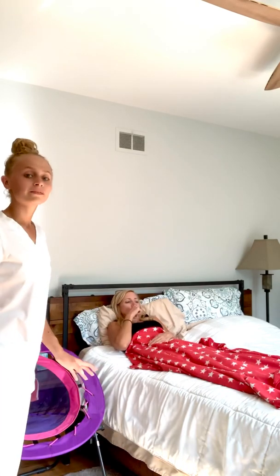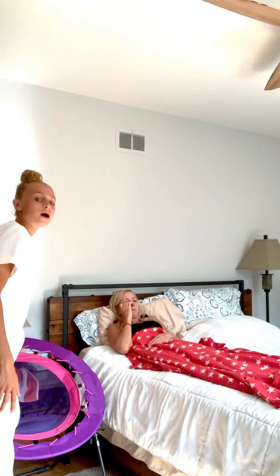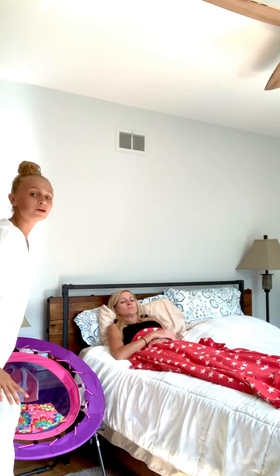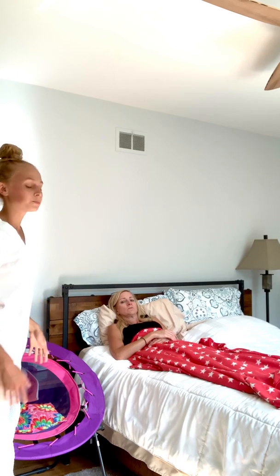So now we have gathered all of our supplies. The supplies that we are going to need today are a cushion that we are going to be placing on the wheelchair, and then a robe, a bath towel, non-skid footwear, a paper, and also a transfer belt.